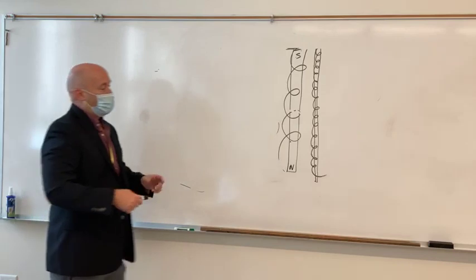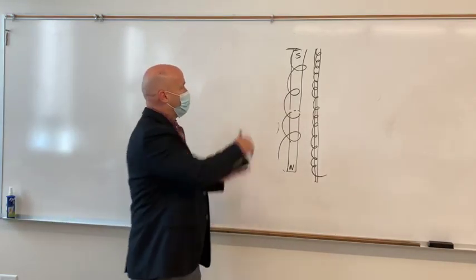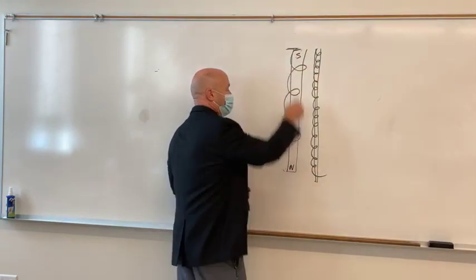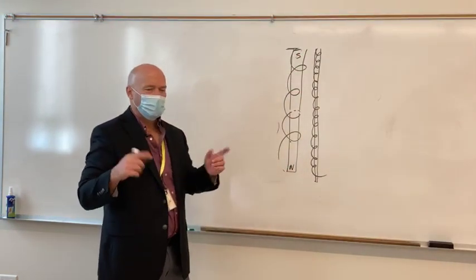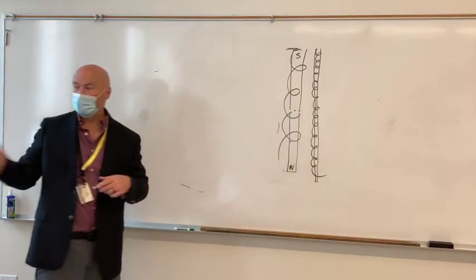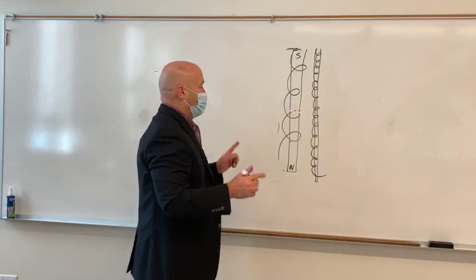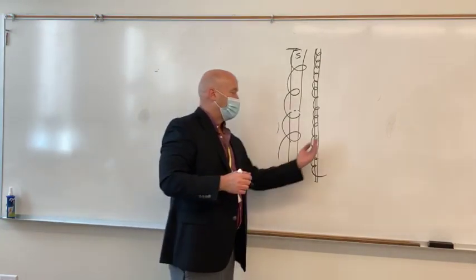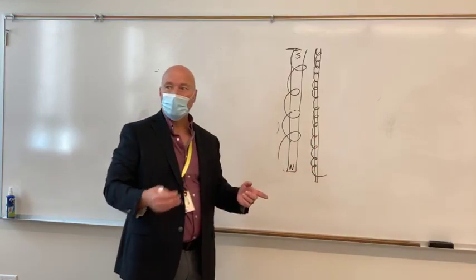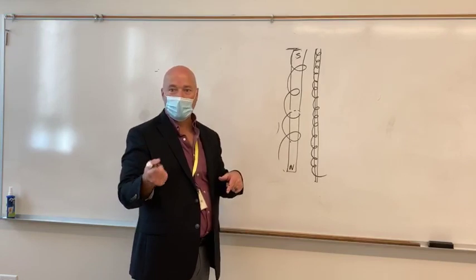Okay. So what we have in hysteresis also is, because we've got a changing magnetic pole strength over here. I don't remember if I took it out of the notes or not, but it's out of the textbook for sure. But Lenz's law is another law that states that the magnetic field that's induced in the secondary side opposes the magnetic field that is created in the primary side.